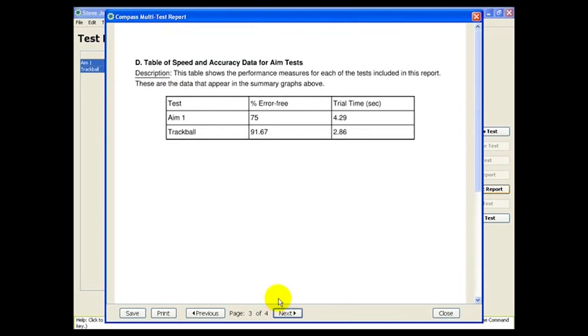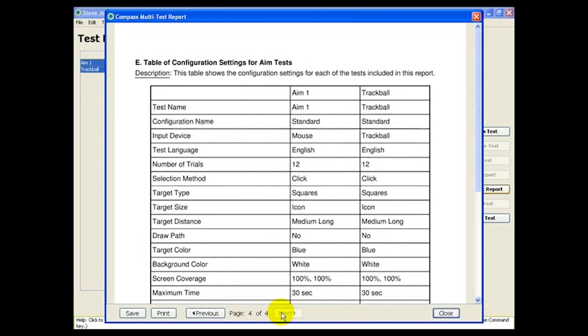Finally, specific numeric data in each test settings are provided, in case you need to refer to them later.